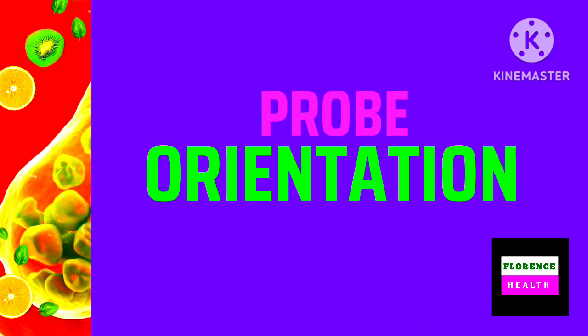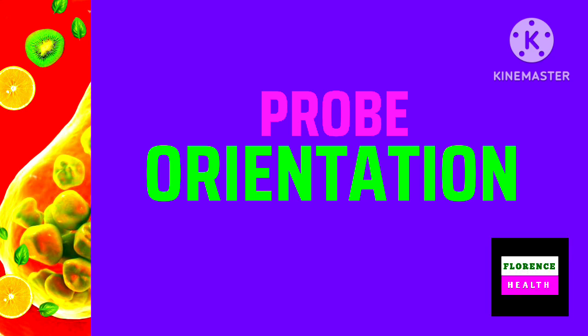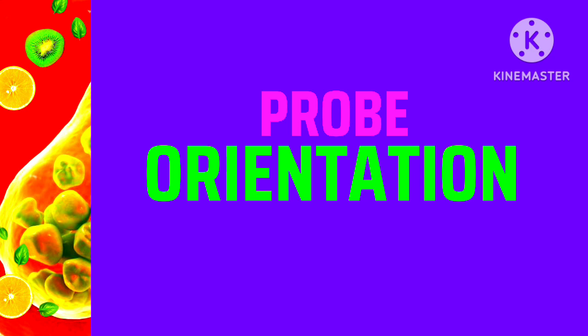Now discuss probe orientation. That means where and how to put the probe when taking longitudinal and transverse sections of an organ. For taking a transverse section of an organ, you should keep the probe marker or probe indicator towards the right side of the body.